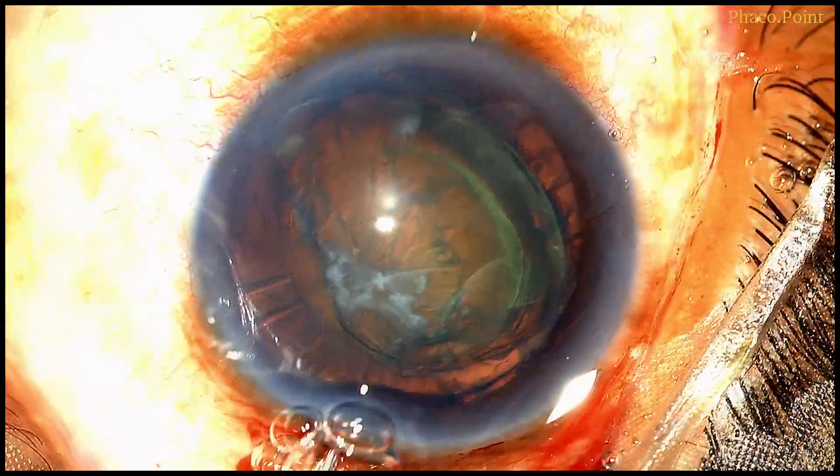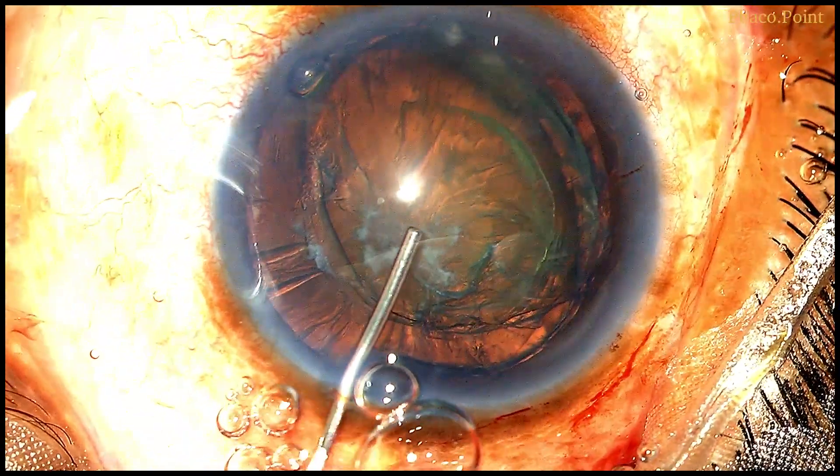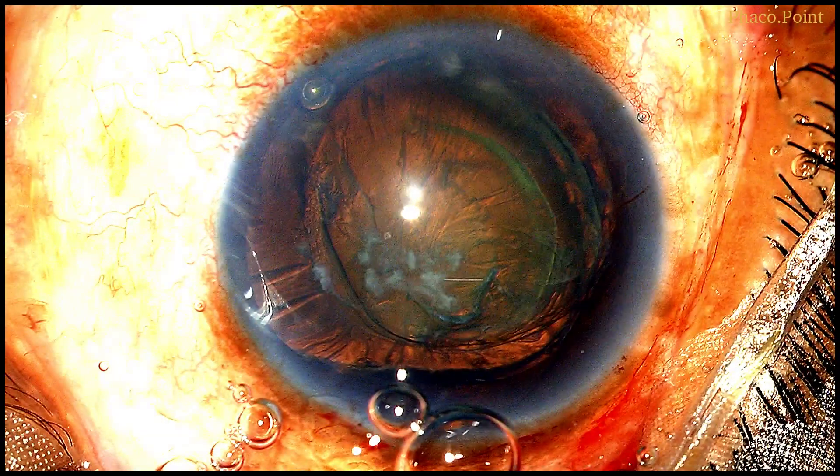Having completed hydro dissection, I now perform a hydro delineation. What hydro delineation does is define the endonucleus, which is all that needs to be emulsified. To recap: we've got perfectly created incisions and a rhexis large enough to allow one pole of the endonucleus to pop out into the anterior chamber. Now we're ready for nucleus management.